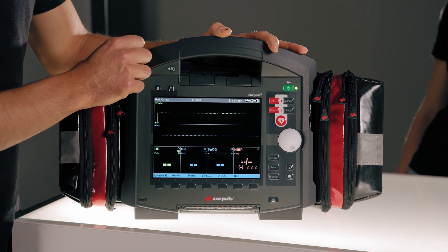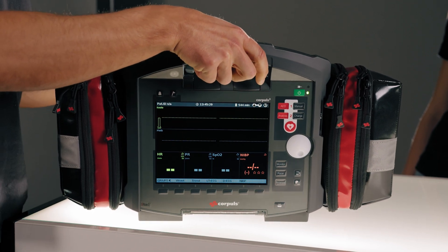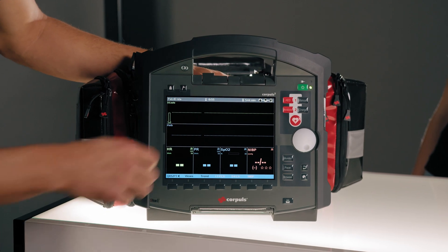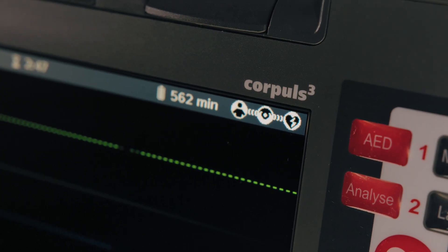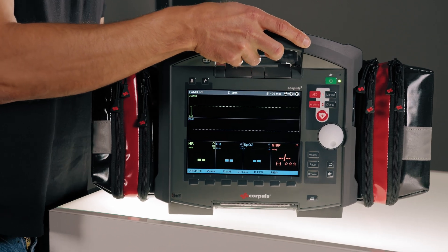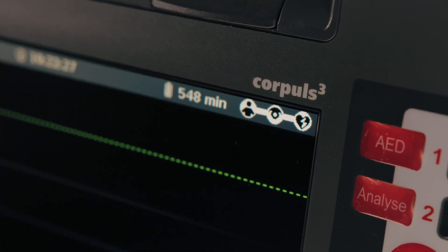The first step is the connection test for the individual modules. As soon as I separate the modules, the white bars change to a waveform. However, all modules are still recognized. If I reconnect the modules, we see the two white bars again.